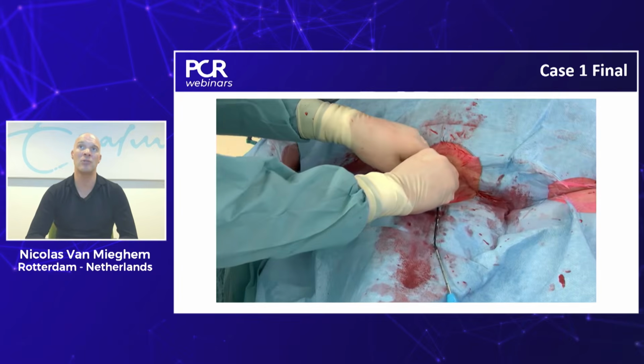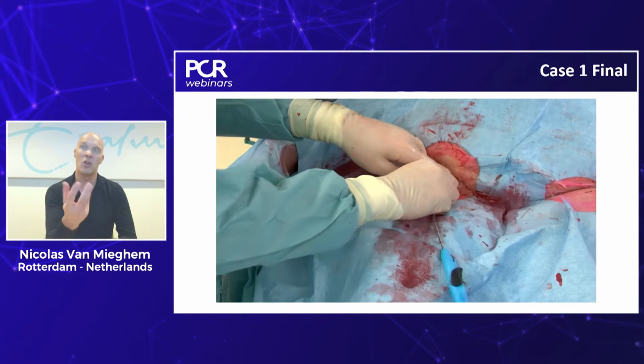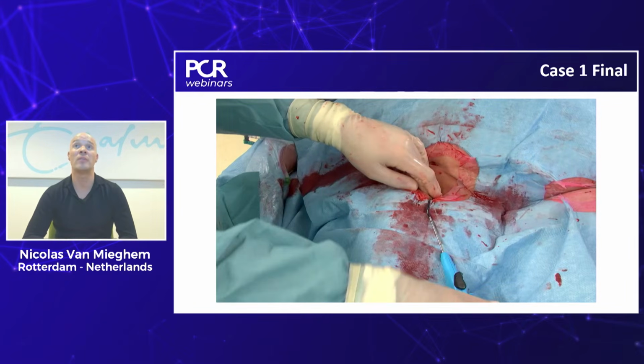So, and then here is the magic of that single access site. It becomes very easy to assess because I have a catheter right beneath to confirm that I have a nice closure. And then at the end of the procedure, I take out the 6 French sheath and use another suture to close my superficial femoral arterial access.